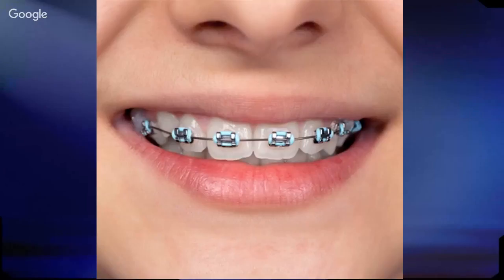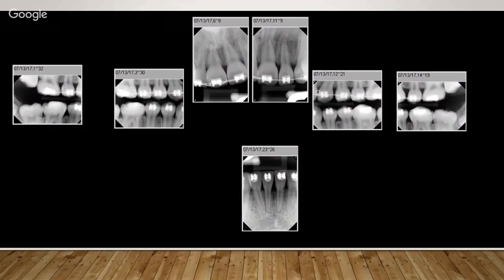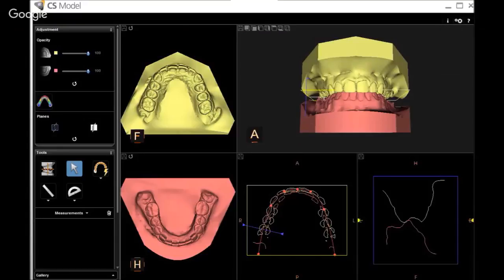Now, we've been doing orthodontics also for over 20 years in our practice, conventional orthodontics with brackets. And now we're finishing every case using clear aligners because it's so easy and it's so accurate. The hardest part about finishing an orthodontic case is finishing. Finishing a case takes the longest because you're trying to micro move the teeth to the proper positions and get them all aligned and so on. So in this case, for example, with Abby, this is where she started. We had her in brackets and wires for a period of time, and about 3 months before she's ready to be finished, we'll go ahead and switch her over to clear aligners.